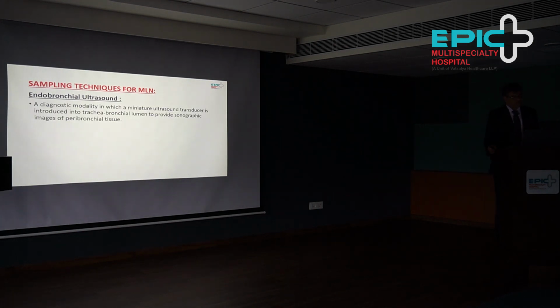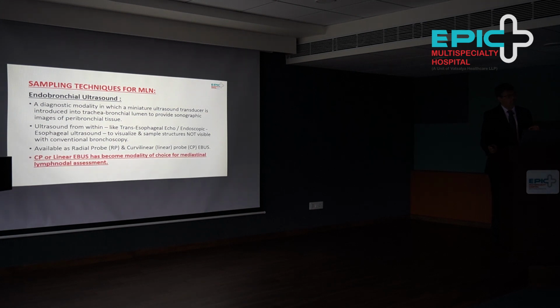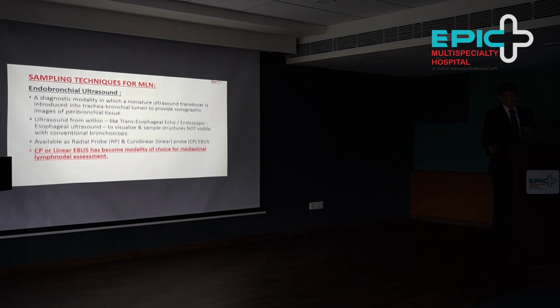It is a diagnostic modality in which a miniature ultrasound transducer is introduced into the tracheobronchial lumen to provide sonographic images of peribronchial tissue. That is like ultrasound from within, like a transesophageal echo, or like esophageal or endoscopic ultrasound. It visualizes structures which are not visible in the conventional bronchoscopic view. It is available as a radial probe as well as a linear probe. What we have at EPIC is linear probe EBUS, where we have real-time guidance of sampling of mediastinal lymphadenopathy. And it has now become the standard of care to use EBUS to sample the mediastinal lymph nodes.